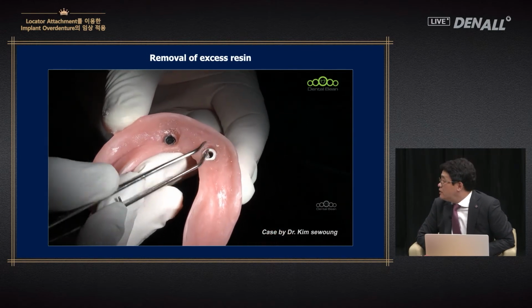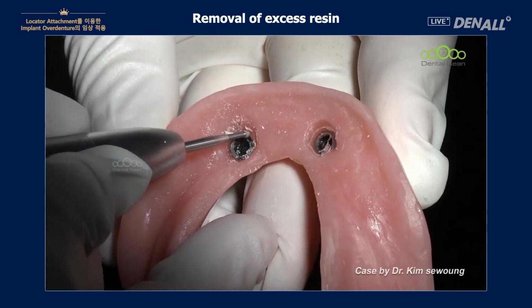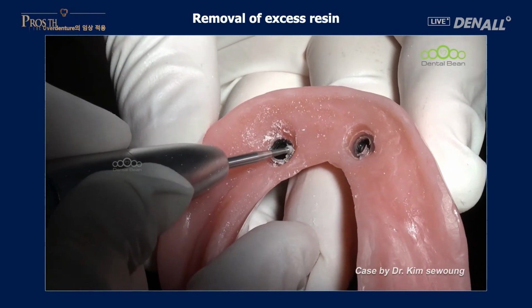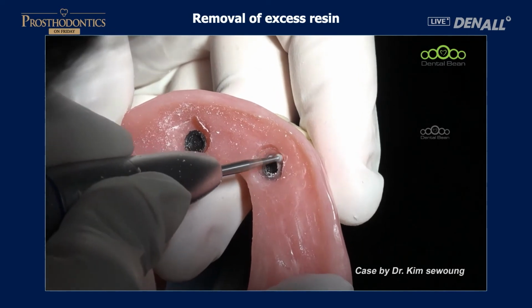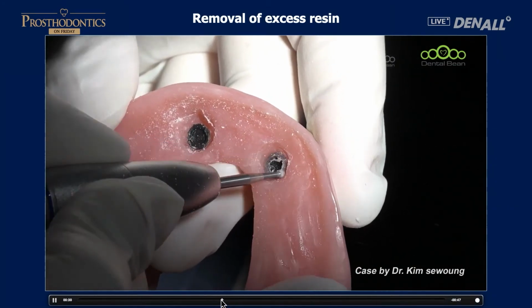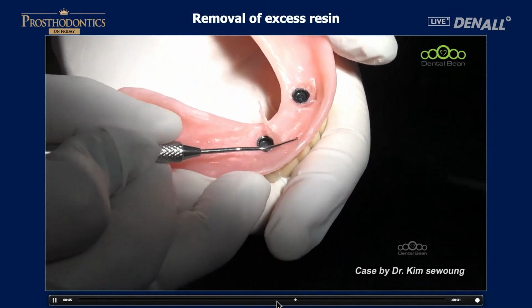Because the color is the same, you don't really know what is the excessive resin, and you trim the surroundings slightly. Trimming. As you can see, it is removed very easily. Yes.